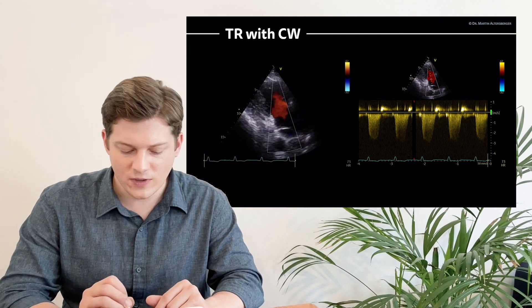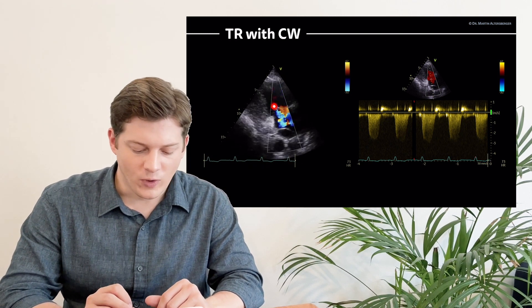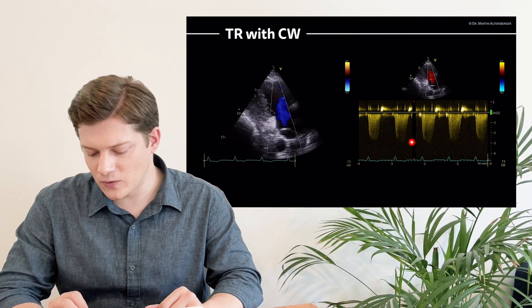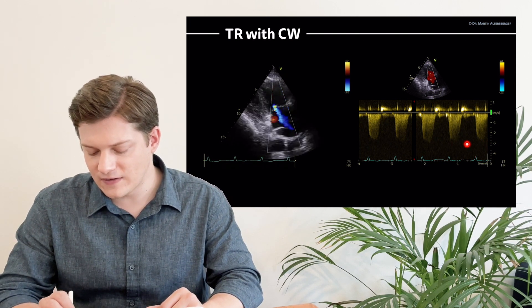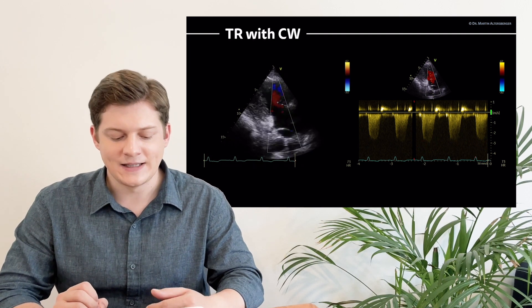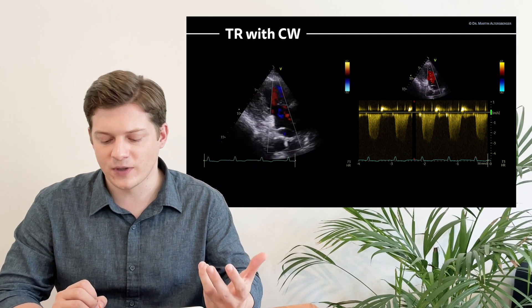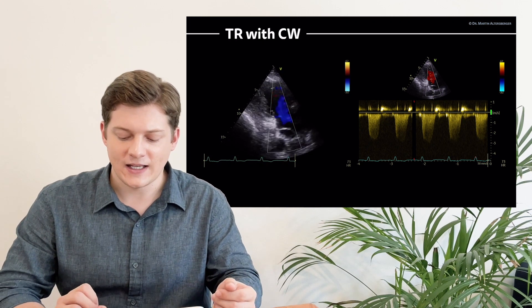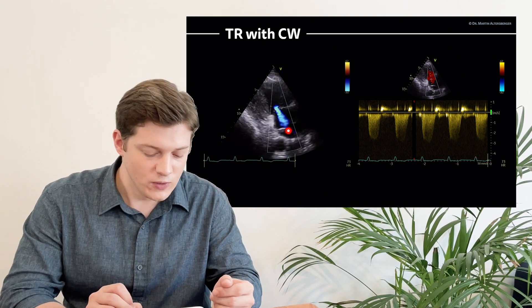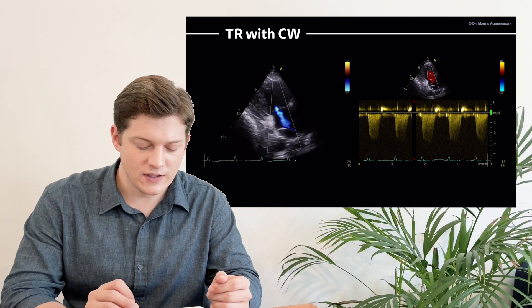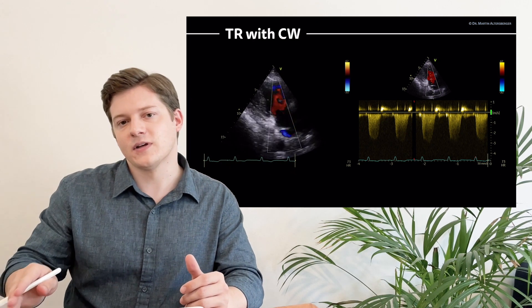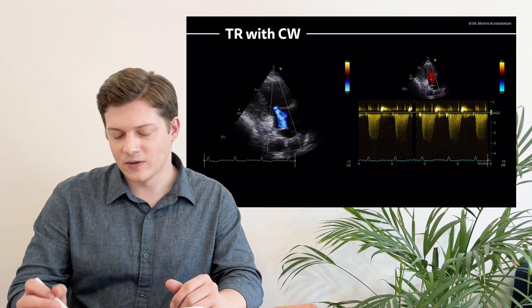You can grade the tricuspid regurgitation here — in this case it's probably moderate. With continuous wave Doppler placed, you can see that the signal is around three meters per second, indicating elevated systolic pulmonary arterial pressures. It can be measured quite well here because the TR is perfectly aligned with the angle of the continuous wave Doppler.